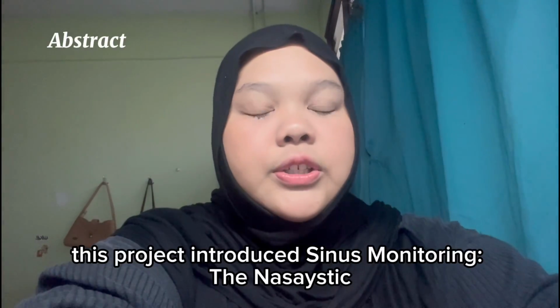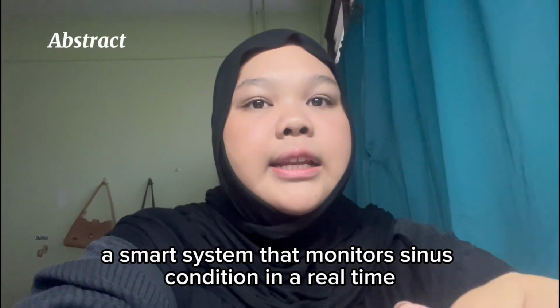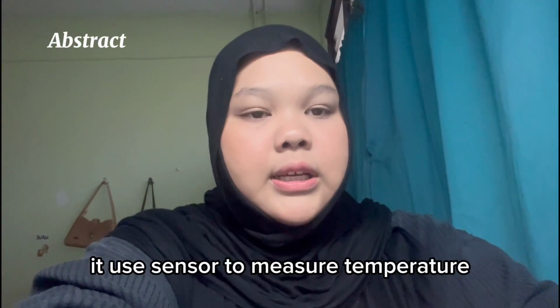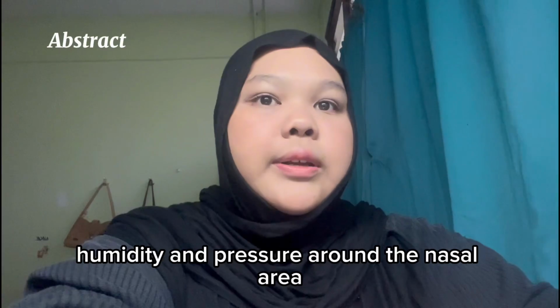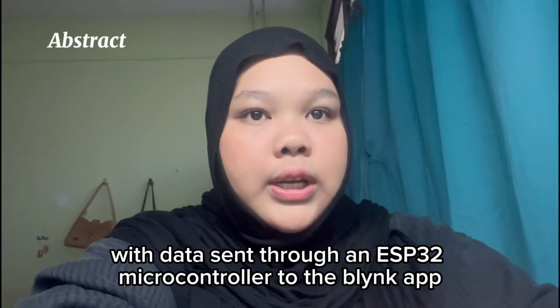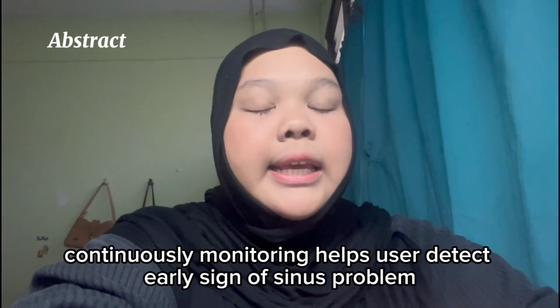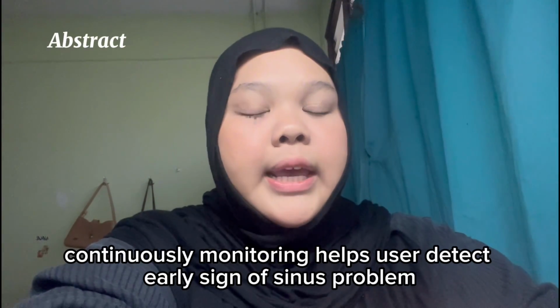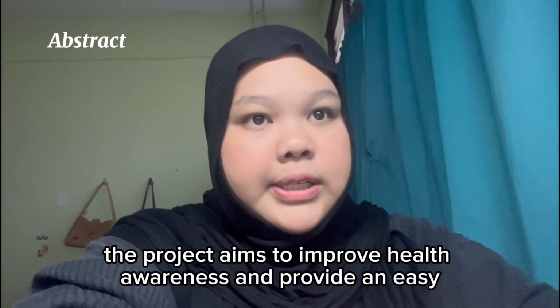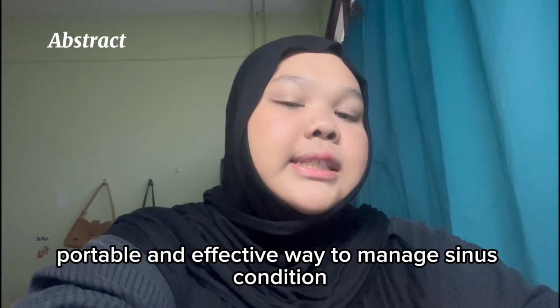This project introduced sinus monitoring, the Nasalystic, a smart system that monitors sinus condition in real time. It uses sensors to measure temperature, humidity, and pressure around the nasal area, with data sent through an ESP32 microcontroller to the Blynk app. Continuous monitoring helps users detect early signs of sinus problem and take preventive action. The project aims to improve health awareness and provide an easy, portable, and effective way to manage sinus condition.